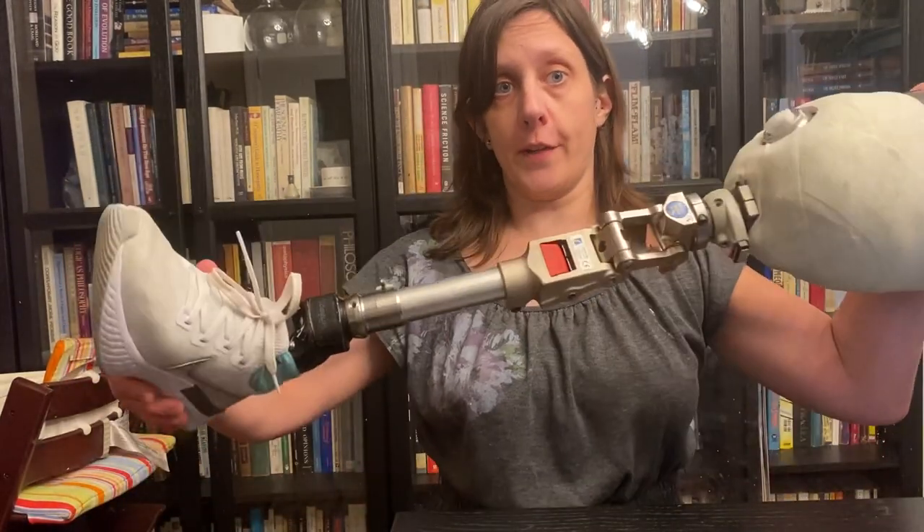Hi everybody, this is Christina, the Amputee OT. In this video, I'm going to show you how a prosthetic knee works.